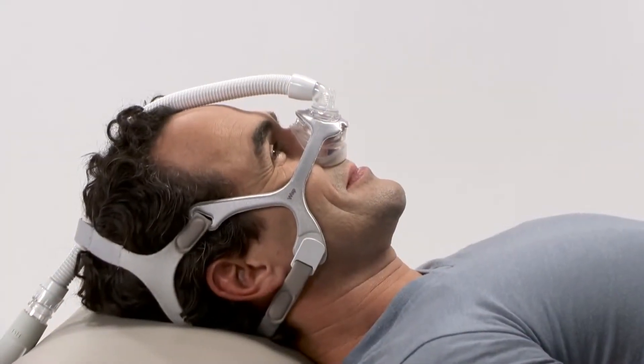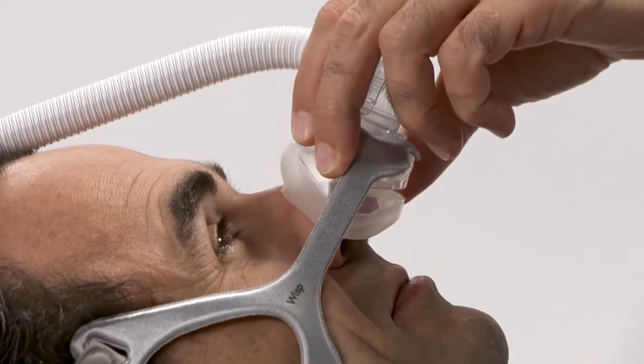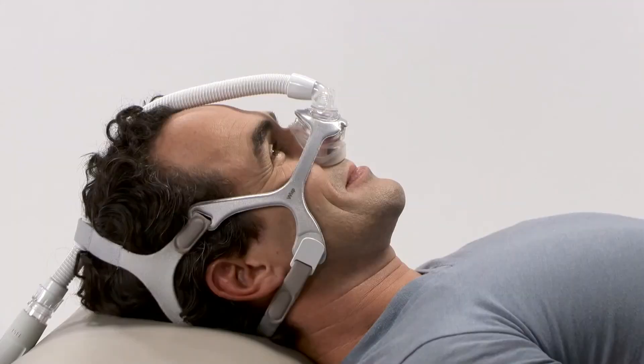In the event of leaks, reseat the mask by pulling it directly away from your face and gently setting it back into place. This allows the cushion to create a new seal.